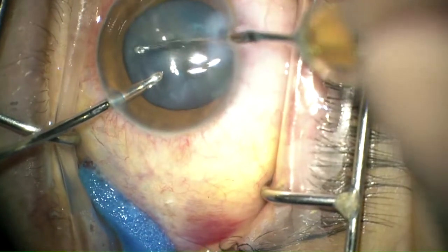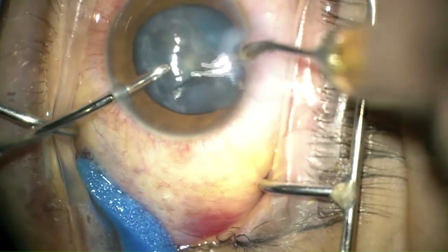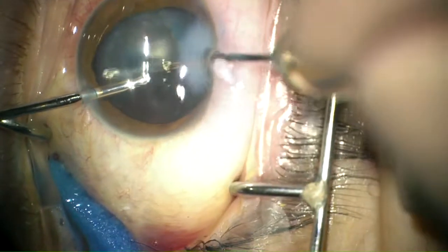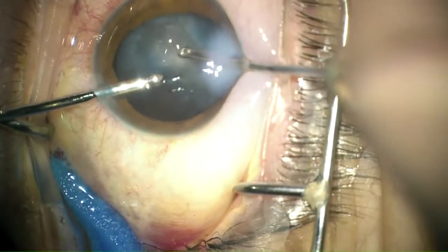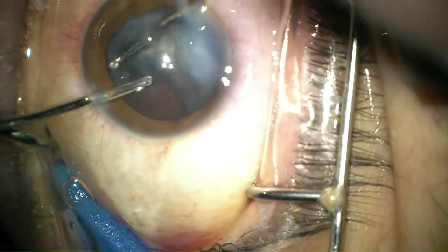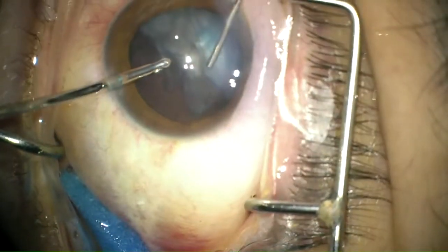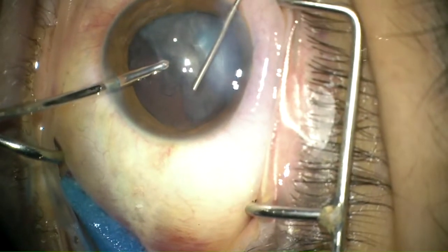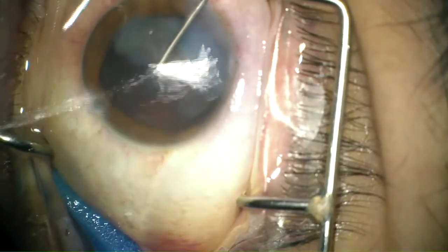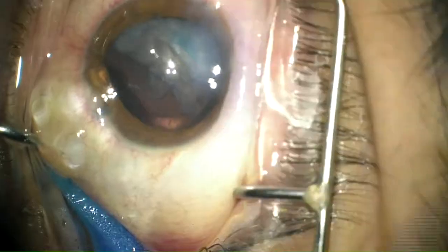The lens was then aspirated using bimanual irrigation-aspiration, making sure not to apply any tension over the anterior capsular edges that might cause the ruptured anterior capsule to run more posteriorly. An important point is to maintain anterior chamber stability during the procedure to decrease the risk of posterior capsule involvement in the rupture. This is achieved by injecting viscoelastic substance before withdrawing the irrigating cannula.